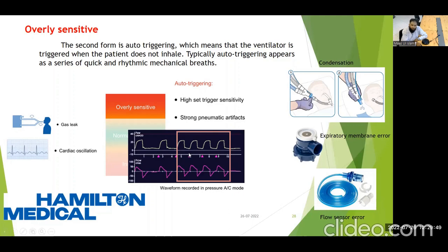Here is a trigger, here is a trigger, and here is a trigger. The patient is sedated, paralyzed, totally non-active or passive.